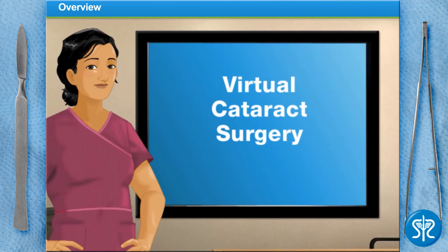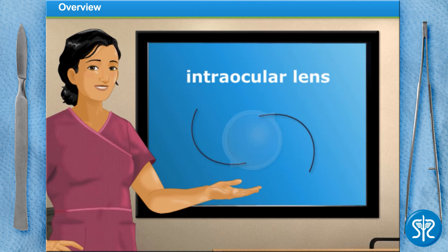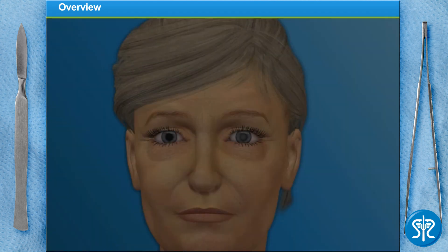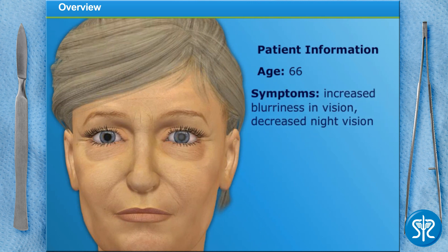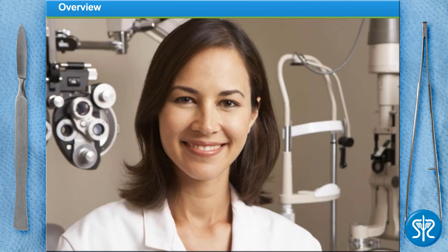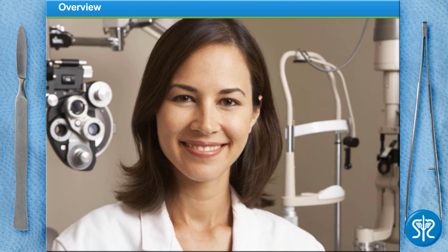We are going to remove the clouded lens and replace it with a new one called an intraocular lens, or IOL. The surgery takes about an hour and can be done on an outpatient basis. Today, our patient is a 66-year-old woman who has noticed an increased blurriness in her vision, as well as decreased night vision. She saw her eye professional and she detected cataracts and recommended her to us for surgery.